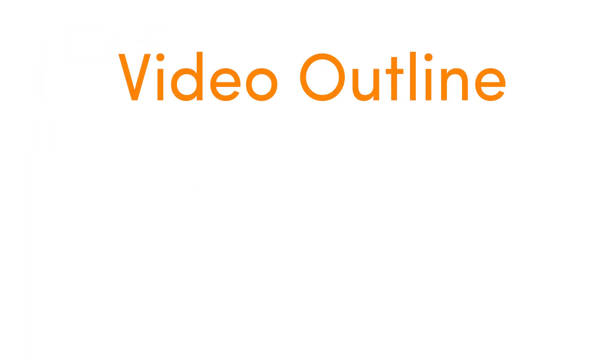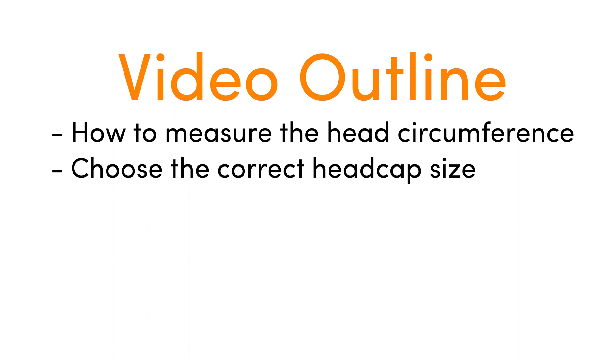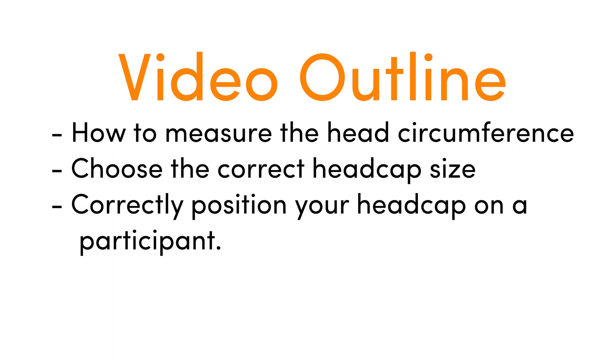In this video, we will show you how to measure the head circumference, choose the correct head cap size, and correctly position your head cap on a participant.